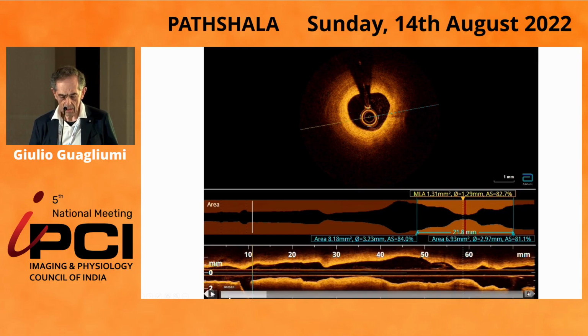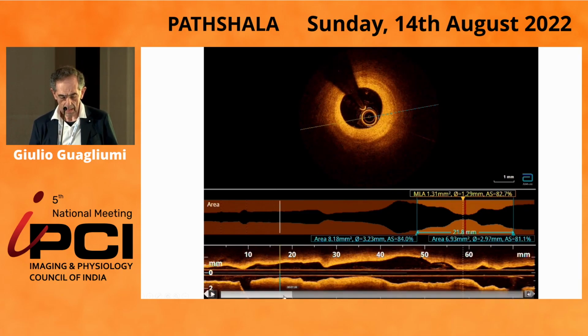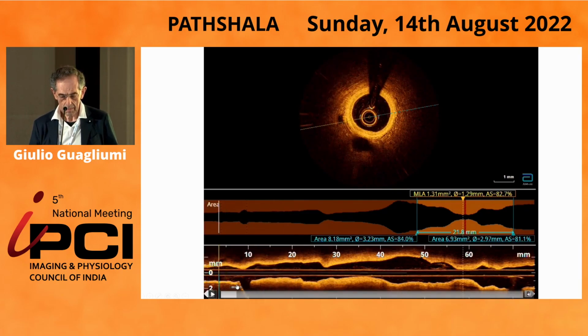And here you can see the acquisition done by OCT. Distal part, proximal part, automatic lumen profile. Here we can go back. This is on the RIMA or the LIMA? This is the radial artery. Radial, yeah, okay. The LIMA and the RIMA were perfectly patent and normal.